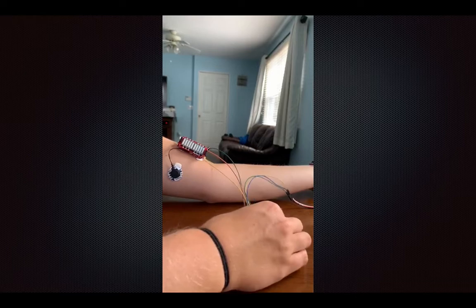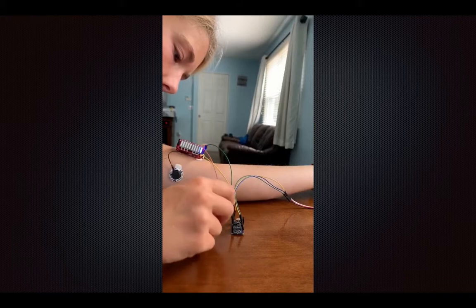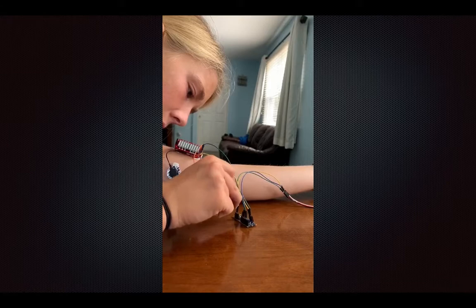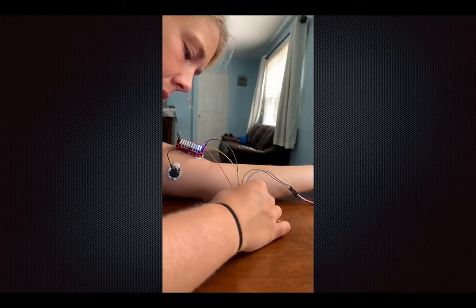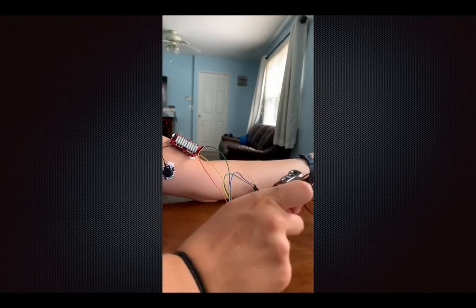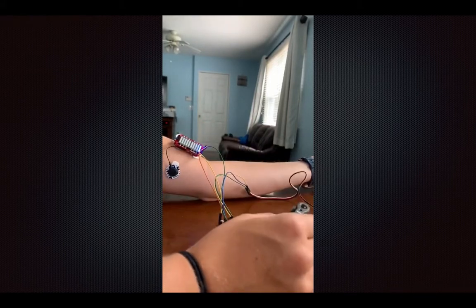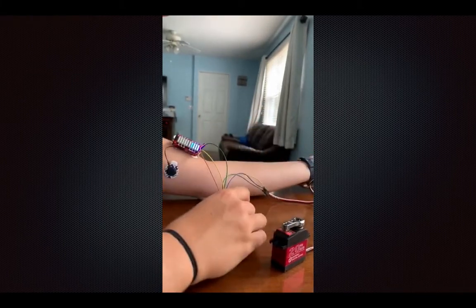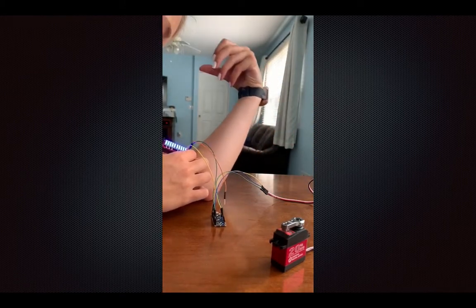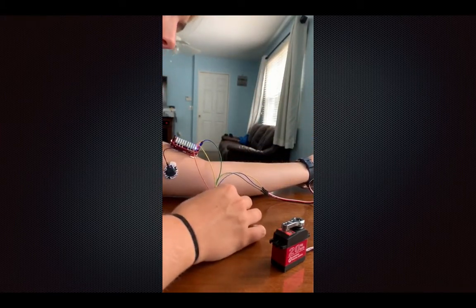So when we're doing this, once all the wires are attached and stay in place, let me solder it better. This should make the motor move, but when we had to leave school because of coronavirus, we never got to figure the wiring out perfectly. So this doesn't produce the right output even when it's at full flexing. It doesn't produce the full output.